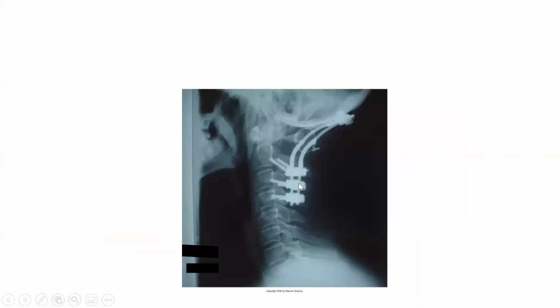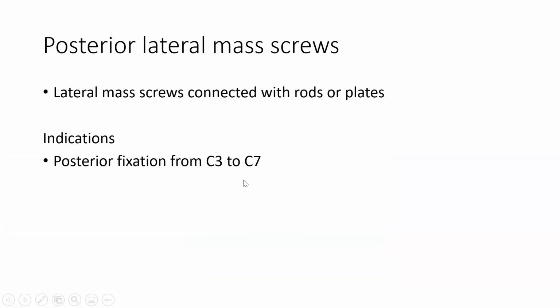You can appreciate that you'll be quite careful when fixing the skull to the cervical spine that you don't end up with the patient's head in extension or flexion because they're now fixed, and you take it for granted, your C0-C1 flexion extension. If your head's fixed, you may not be able to look ahead or achieve a comfortable position. So it's very important to make sure you have got the eye gaze orthogonal to basically what you're fixing onto. These are lateral mass screws. I'll show you some pictures of them now.